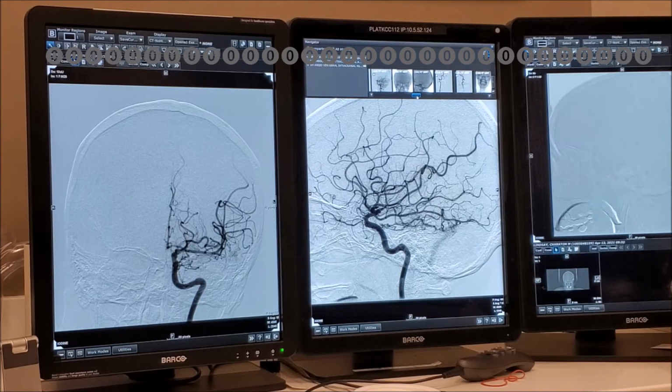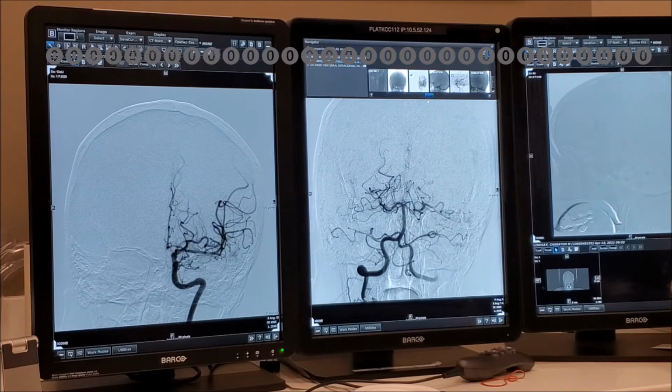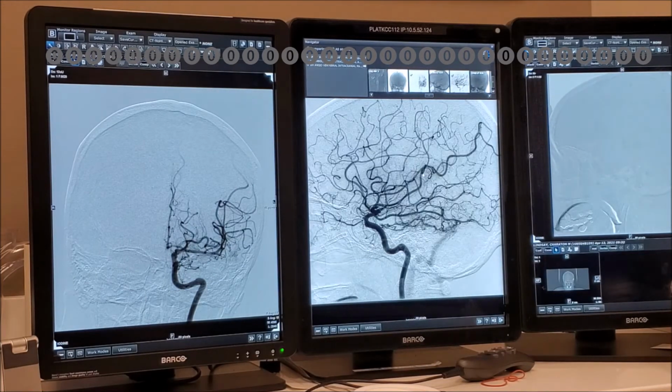From the left vert. Oh, sorry, from the right vert. I'm going to just put it for a moment here. You see it? Okay. So we see this one, right? So we've seen this one before. And now we're going to try to put it together. Okay, so there is contribution to the lesion, but we know there's going to be something more juicy.